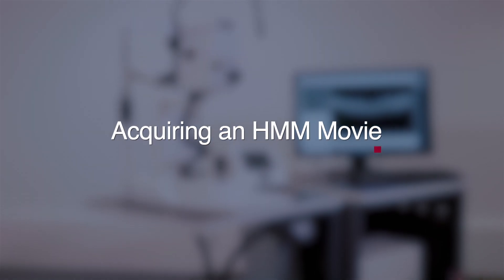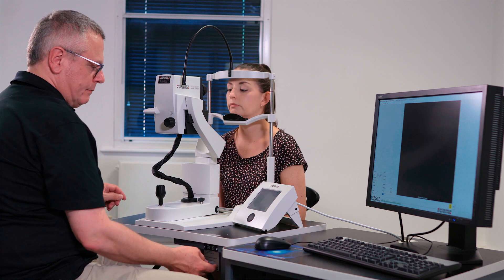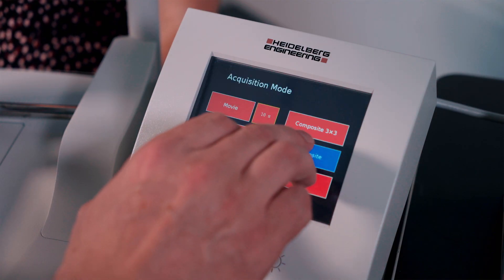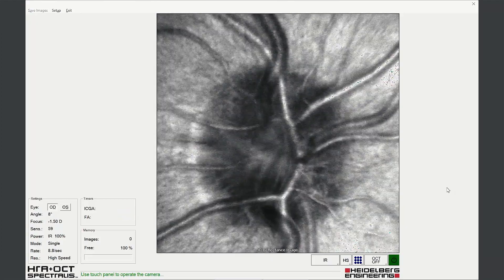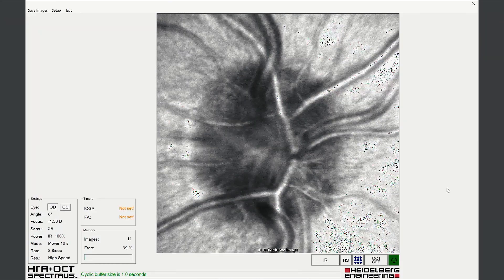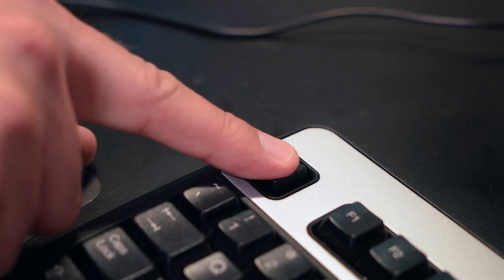Acquiring a high magnification movie sequence. Align the patient as before and select the movie modality. Acquire a short movie sequence of the desired structure. The movie can be stopped at any point during acquisition and saved.